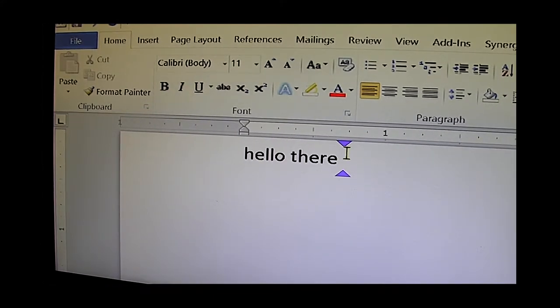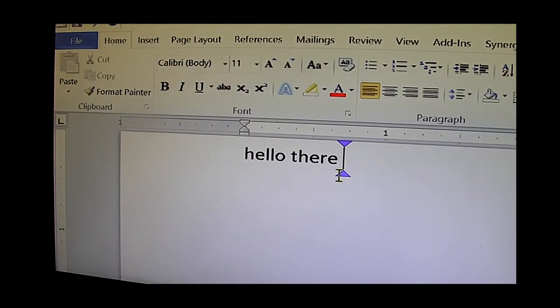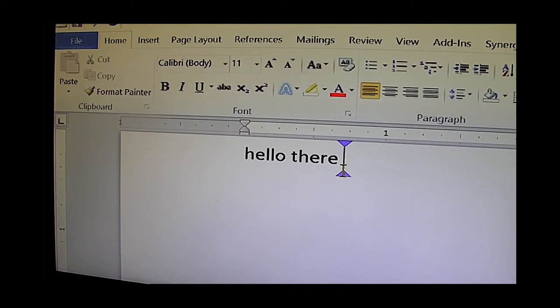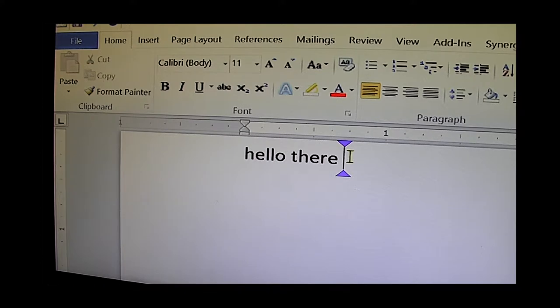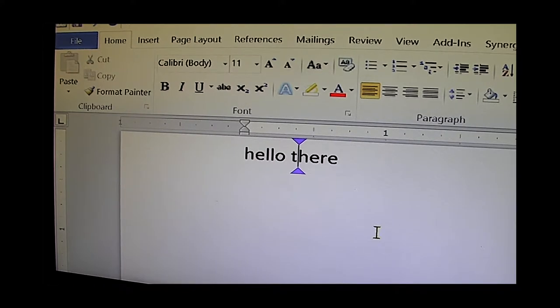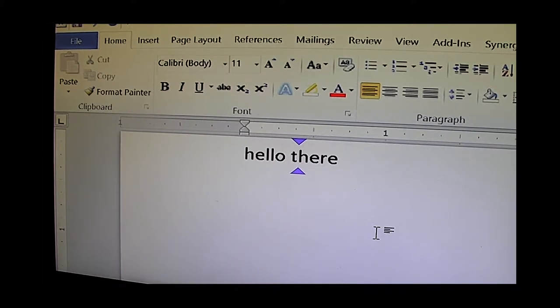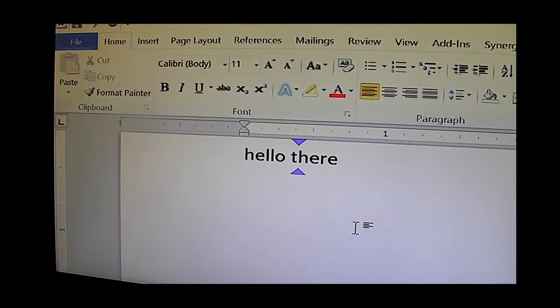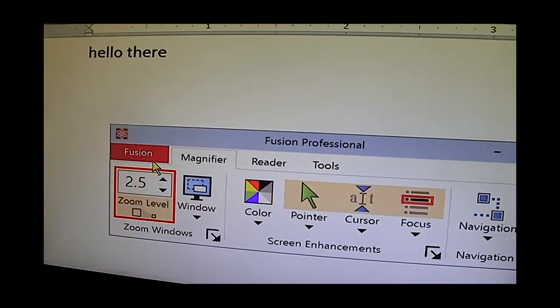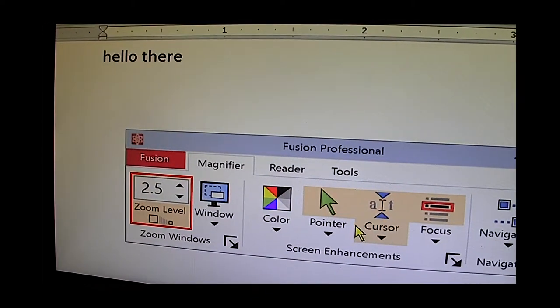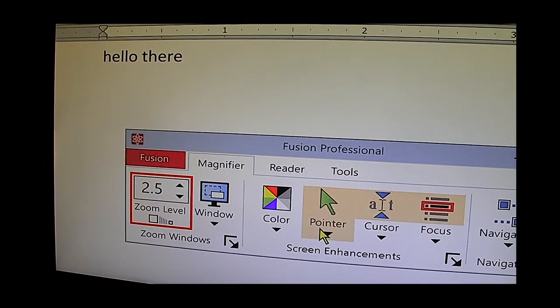There are some enhancements that ZoomText can apply. For example here I've got a couple of blue wedges that are pointing to where the typing cursor is. This can help locate the typing cursor. Similarly I can adjust the mouse pointer as well.